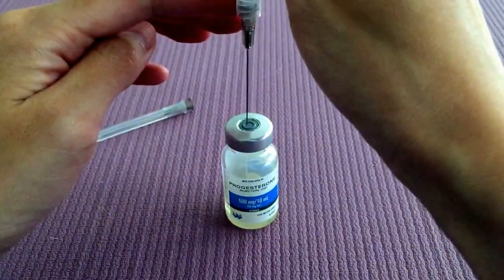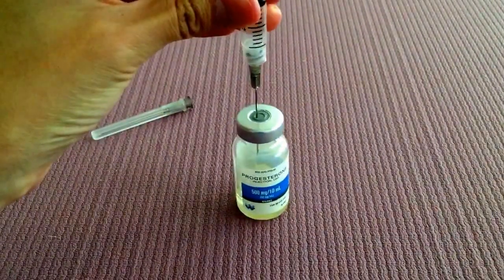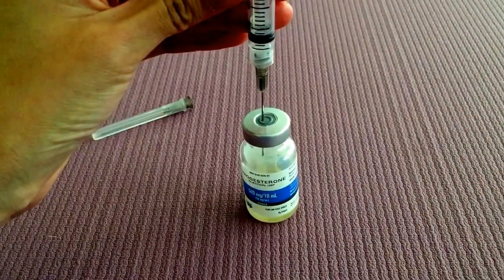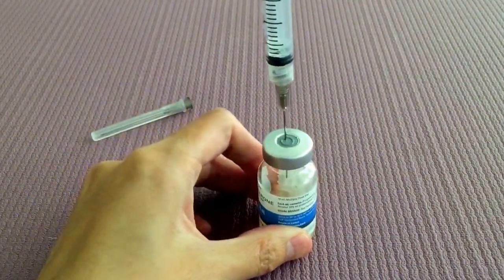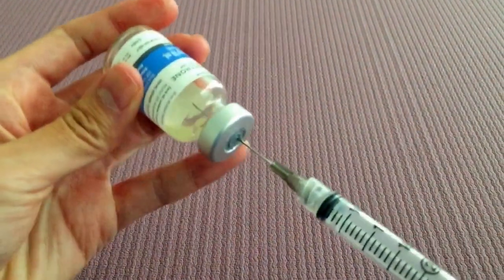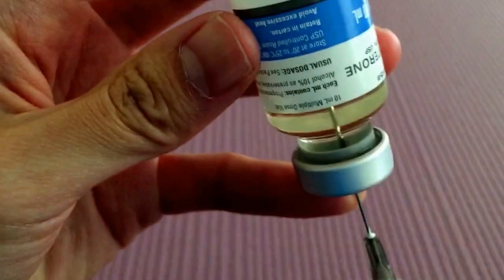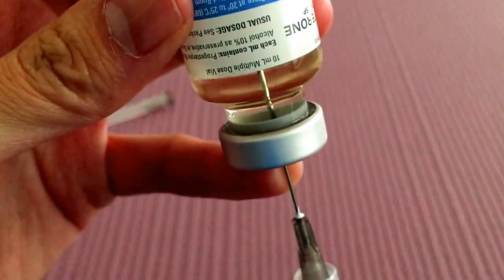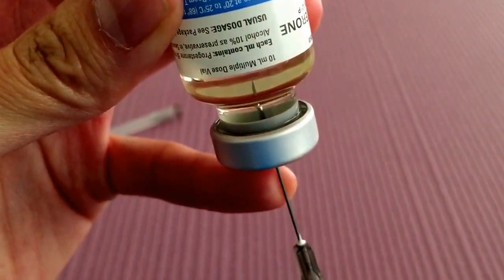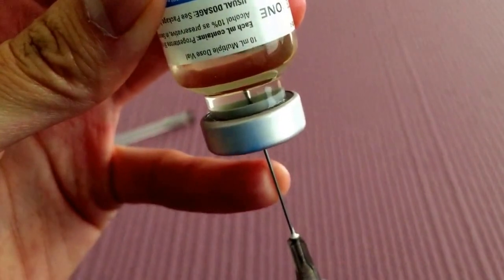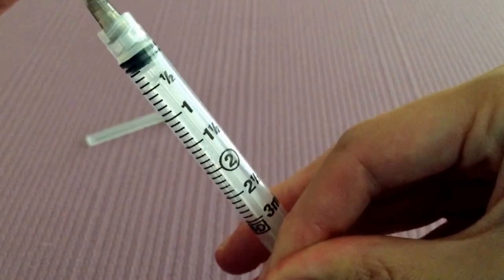So let's do that and push the air in and make sure your thumb is still on the plunger. The next thing you're going to do is flip this upside down and just be careful not to bend the needle. And what you want to do is draw the needle tip underneath the water line, or I should say the oil line in this case. And then once you're ready, you can start drawing up the medication.